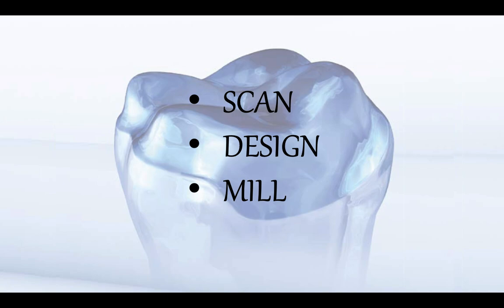Overall, it is related to scanning whatever prep we have completed, designing the crown, onlay, veneer, bridge, implant, whatever we have decided to design, and then we are going to mill in-house. Or we can send the milling to the lab.